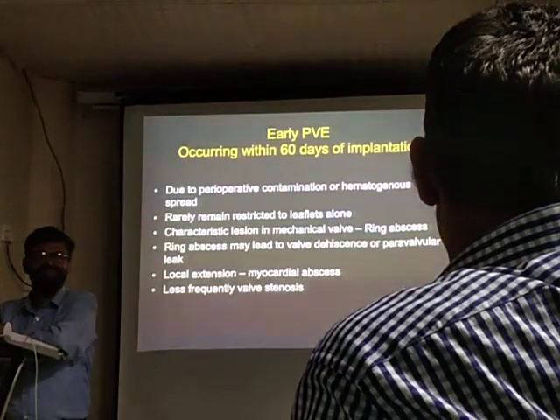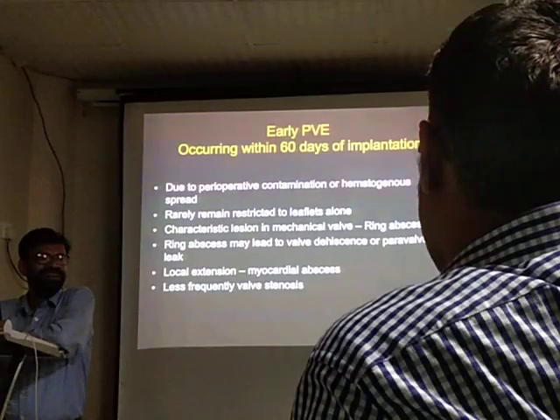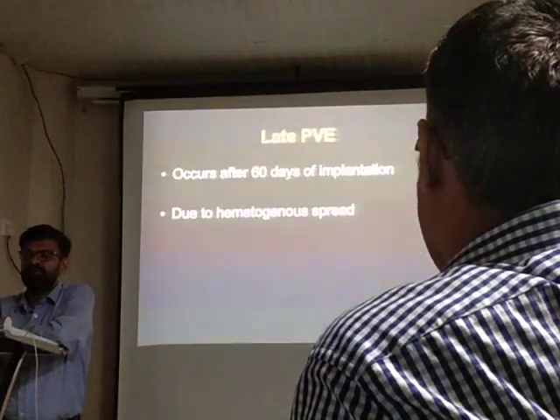Sir, thrombus and vegetation, but clinically, I go by the rule of two. Absolutely. You're a clinician, sir. You're not a technician.